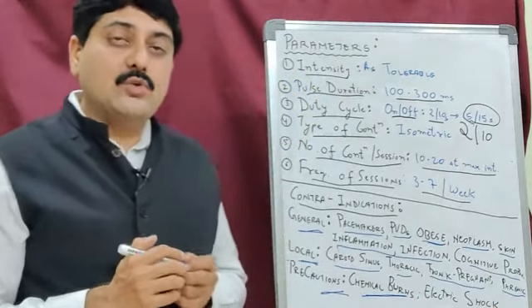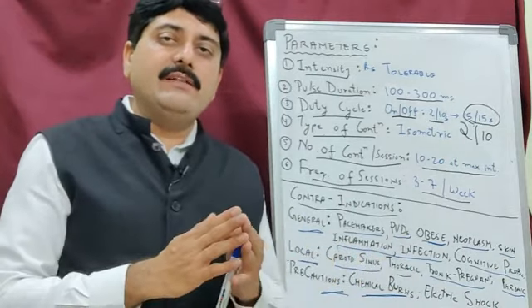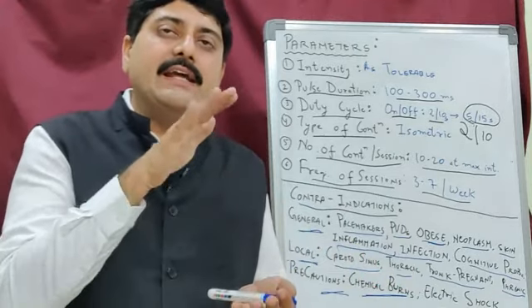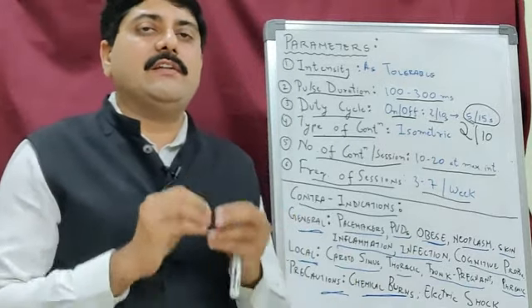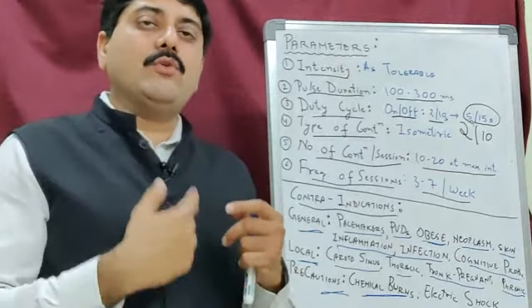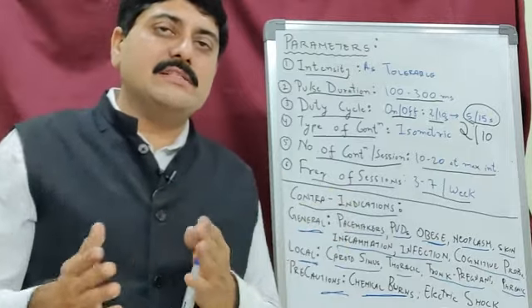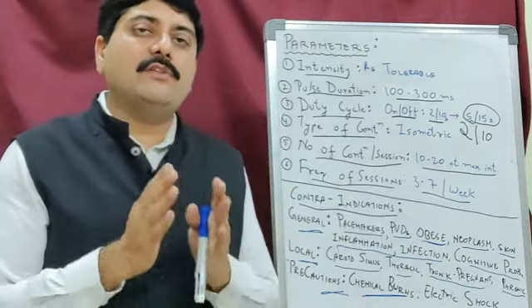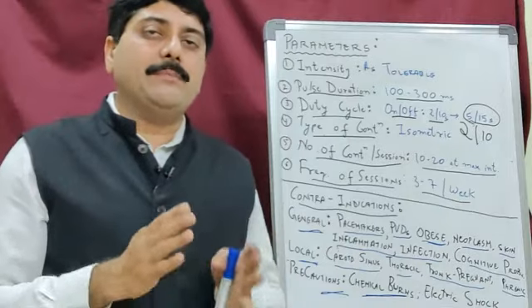Many a time it happens that suddenly the voltage fluctuates or the current goes off, and with this fluctuation of voltage, the stabilizer in the machine sometimes fails. The patient can end up with a shock. So if you are not with the patient, do not turn on the machine, and whenever you are moving away from the patient, keep the intensity at 0. And even before changing each point of stimulation, if you are stimulating a nerve and going for individual muscle stimulation, you have to turn off the intensity each time the electrode comes up from the skin of the patient.